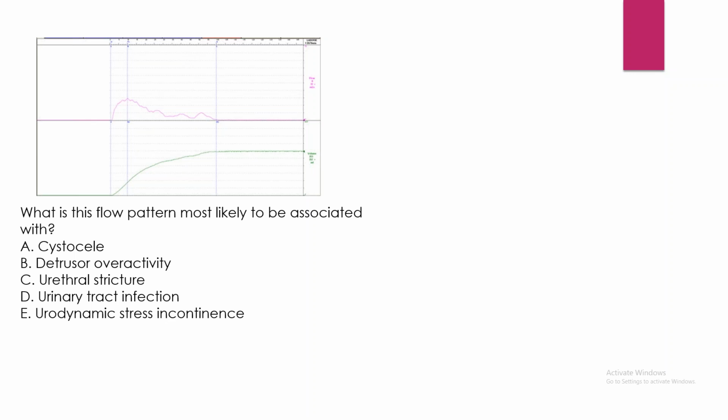Now this is very easy. We have done it so many times. Is this urethral pressure, filling or voiding? It is voiding, ma'am. This is voiding.